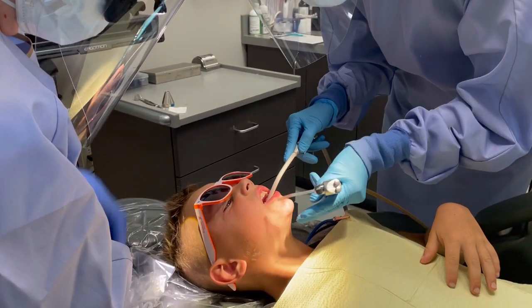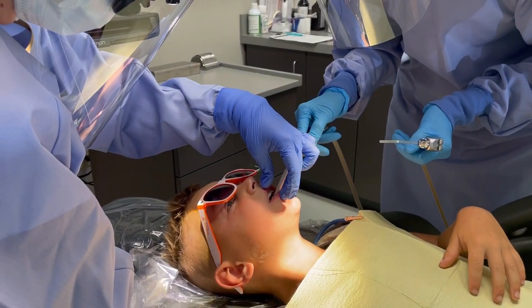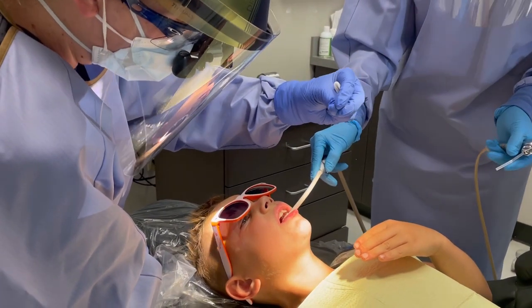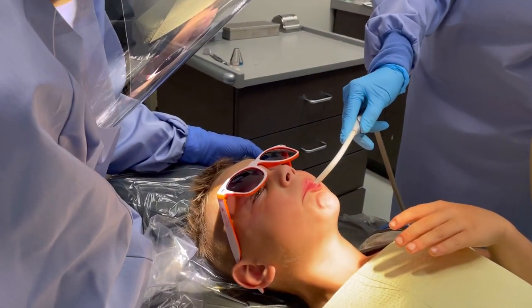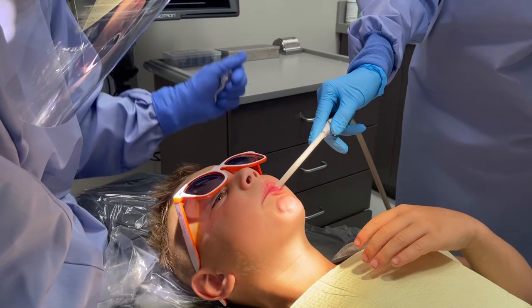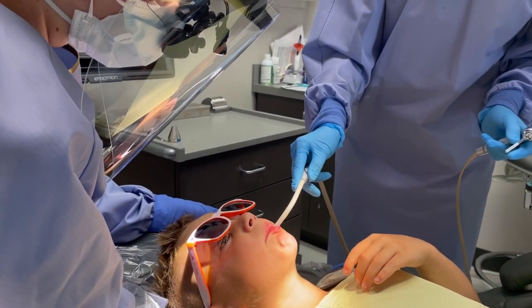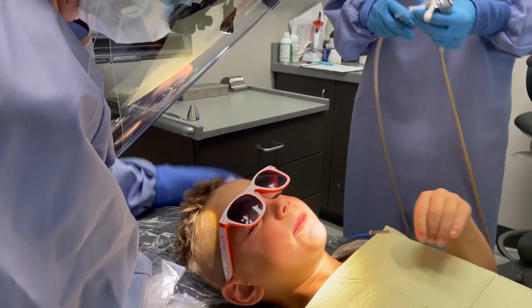You're just taking it like a straw — bring your lips like you're sipping it. Bring your lips all the way together like a fish face. Put the clip with all the stuff in your mouth. Yeah, if you bring your lips all the way together, like you're giving it a nice sip on a straw. There you go. Good job. Open up and then just open whenever you've got it all cleaned out. Perfect. Good job.